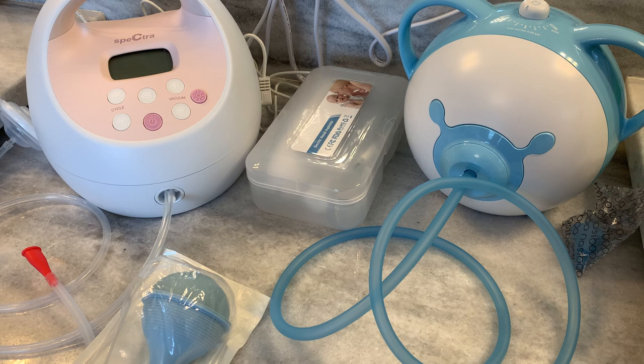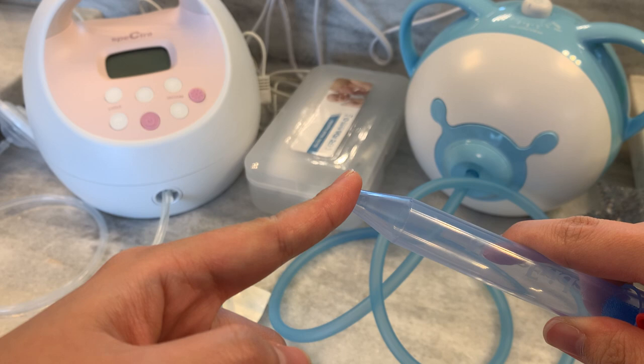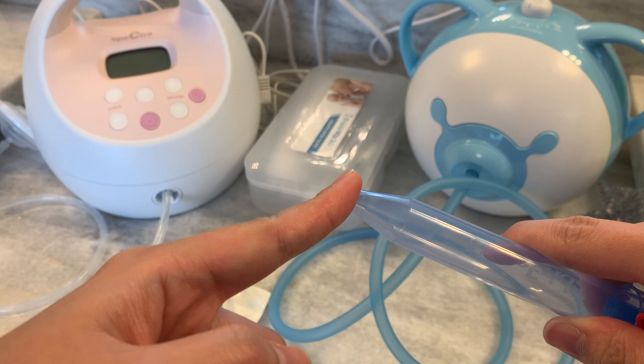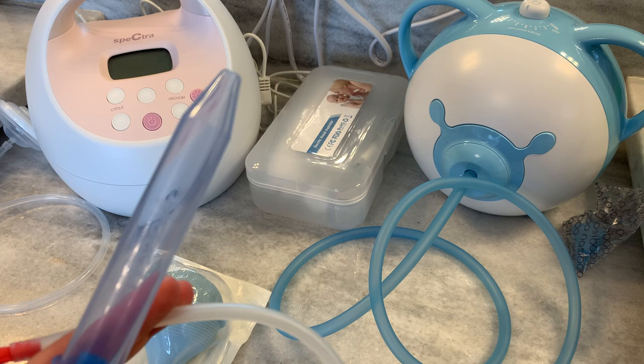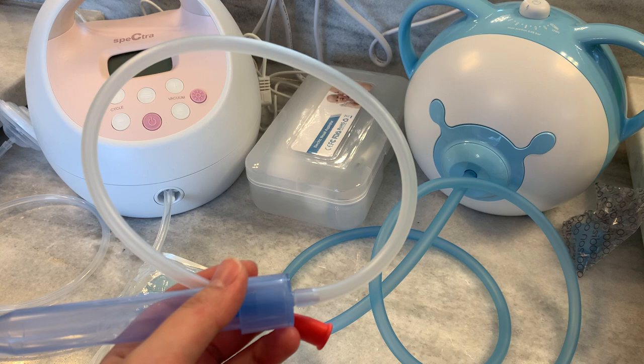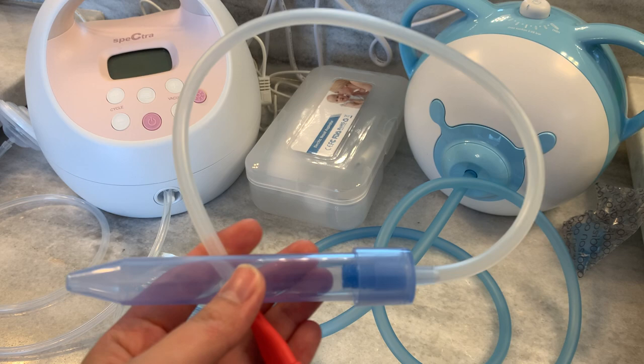So let's start with the Frida. This is the most commonly recommended item for new moms on a registry list. It retails for about $10. You suck with your mouth on this end and place this end in the baby's nostrils. There is a filter here that prevents the mucus from getting to your mouth. For this to work you need the combination of strong lungs, good coordination, and a cooperative baby — and I don't have any of those. I also have terrible lungs, not in a medical sense, but I don't have the power to generate adequate suction for this to work.